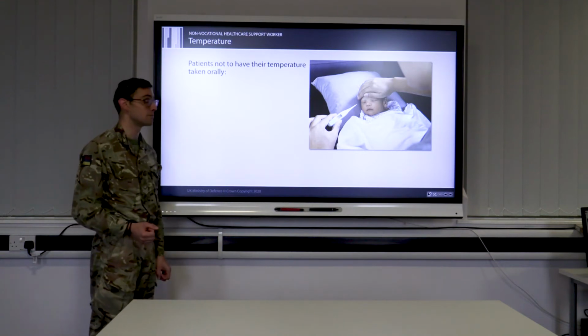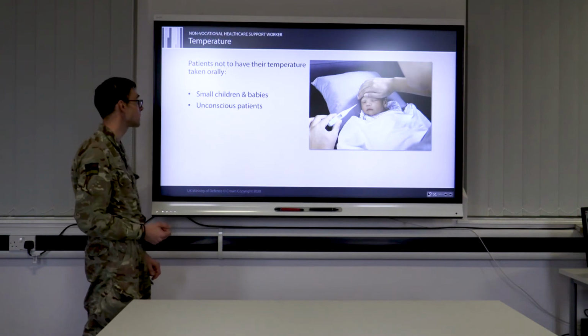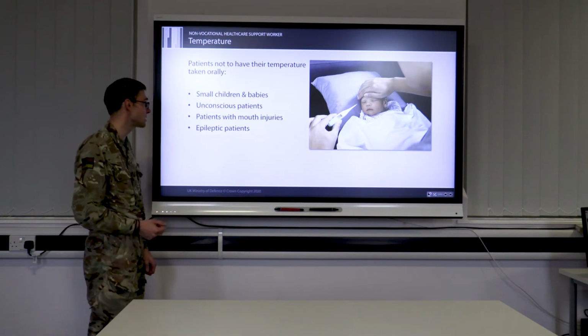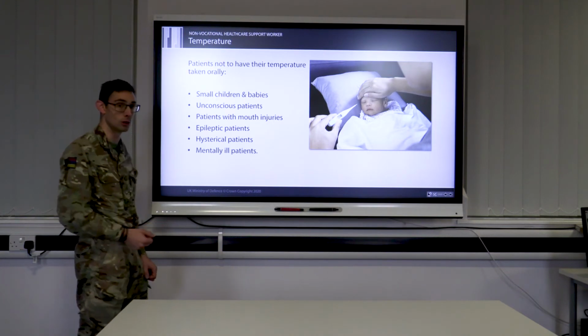Patients not to have their temperature taken orally include small children and babies, unconscious patients, patients with mouth injuries, epileptic patients, hysterical patients, mentally ill patients.